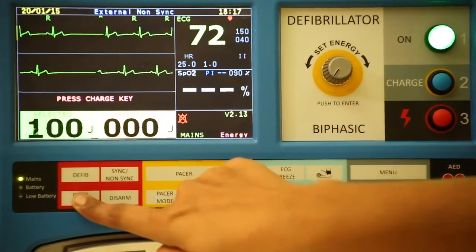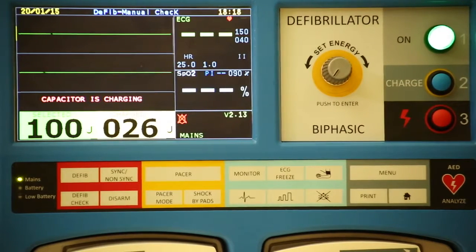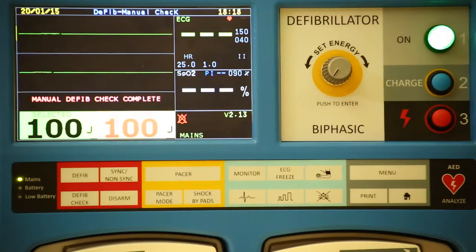Press defib check button to check proper functioning of defib in manual mode. Press the charge button to start the check. The unit charges to preset energy in joules. Then press the discharge button. The manual defib check complete indicates the proper functioning of the unit.